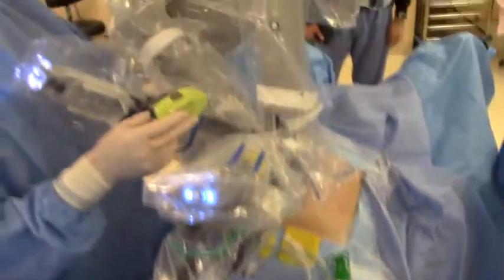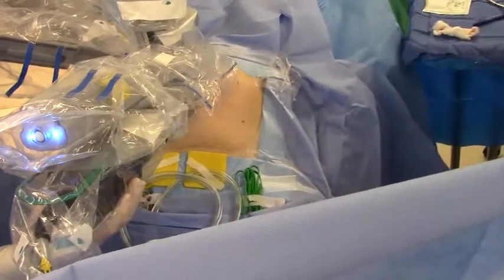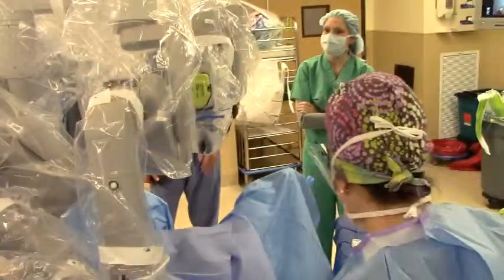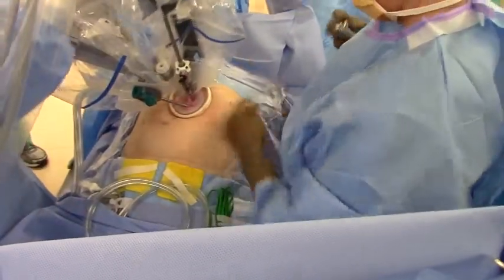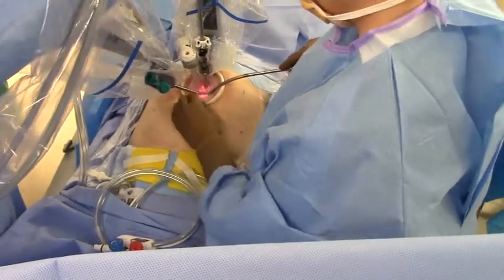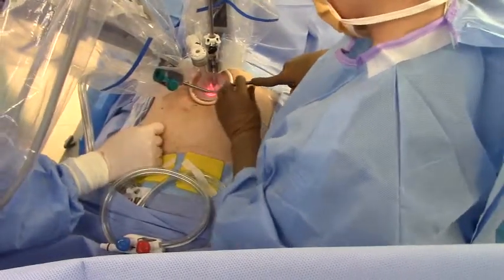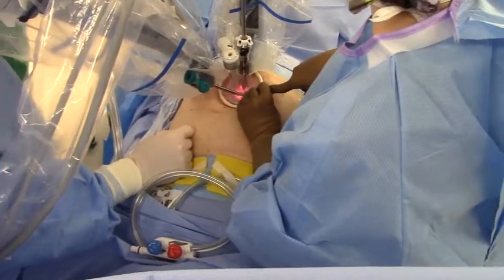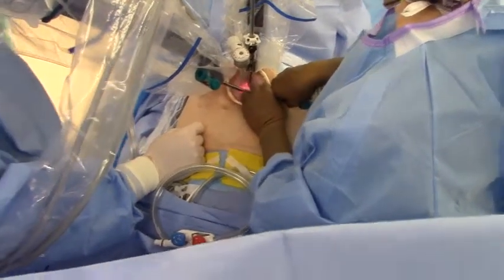I told you I would eventually start getting better. You okay to let them put it in? It's up to you if you're comfortable doing it — I want you to be comfortable. If you feel confident, then I'm comfortable. If you don't feel confident to do it, then I don't mind coming over. I'll give you a pointer: I like to put my index finger here so that you're never going to go farther than that. Look at your screen as you're going in. You'll see in the bottom right. Once you get to where your finger is, you should be able to see it.